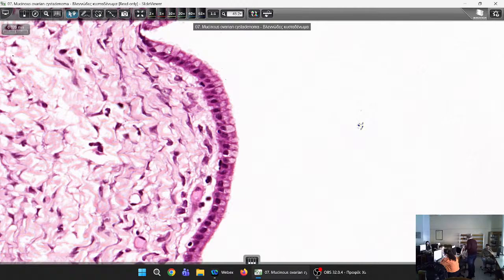And in this case, despite all this invasion of the peritoneum, there is a possibility that the tumor looks totally benign, totally benign. Can you tell me where it may derive from and produce mucin? I don't think it's so difficult. Since it is a mucin-producing tumor in the abdomen, where may it arise from? The intestine, and particularly the appendix.